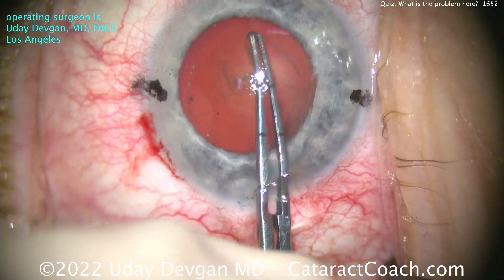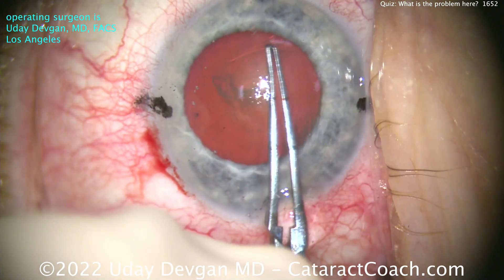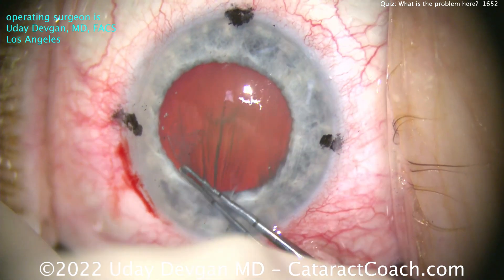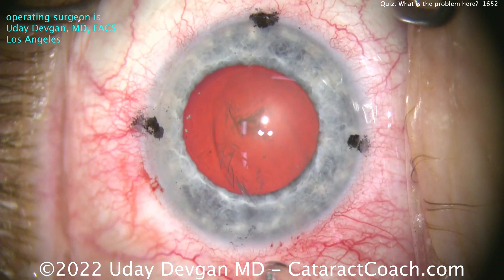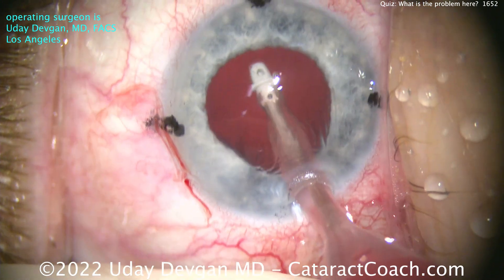No issue here at all. The patient's eye is a little dry — you can definitely tell that. A little bit more of an elderly patient than we're used to; this patient is a nonagenarian, 90-plus years old. The hydrodissection and everything else is fine — the nucleus removal is fine. Let's cut to the end of the case here.